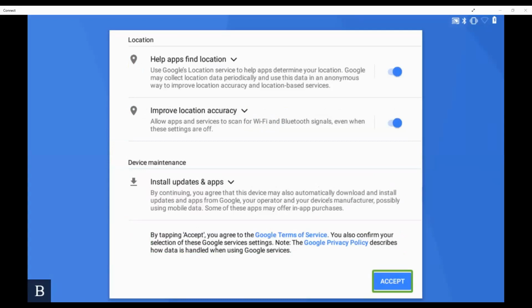And obviously remember, because that's a web view, sorry, Andrew, to jump in, it was a button. So if you're very familiar, you can jump to that using your web things. I agree. Your accept, depending on if you hear the word web view or not, is going to dictate if you can use those web element sort of shortcuts that we've talked about previously. Yeah, so instead of pressing the letter A or M, if there was the More button, you could just press the letter B. That would just jump you to those different buttons.